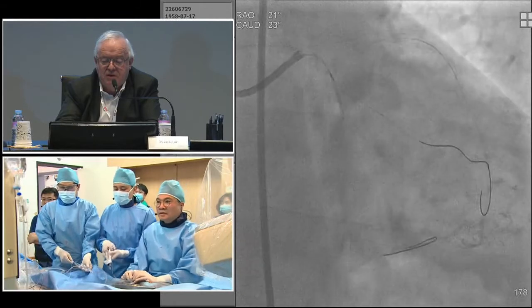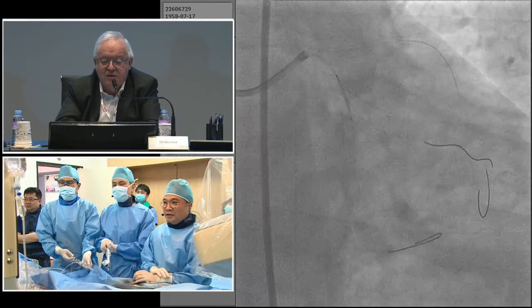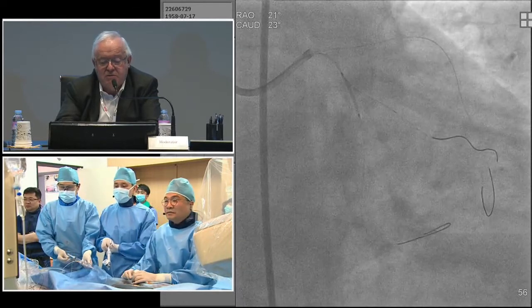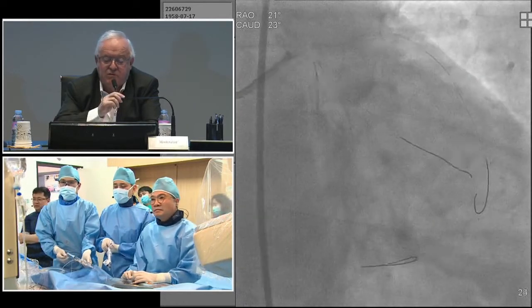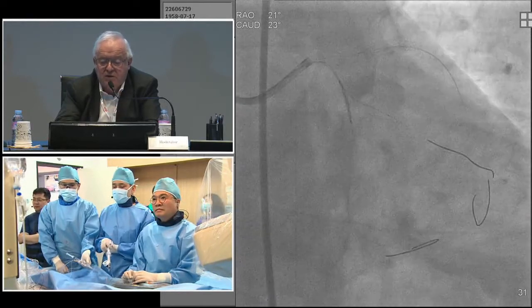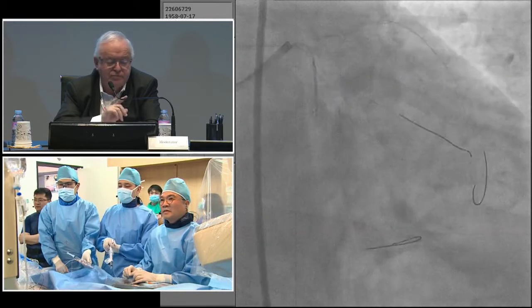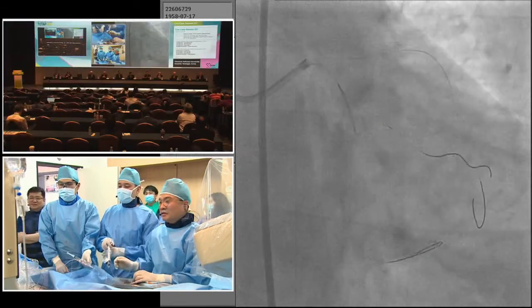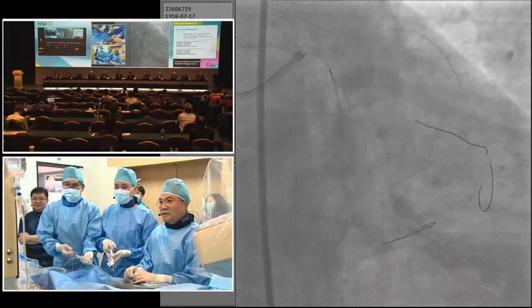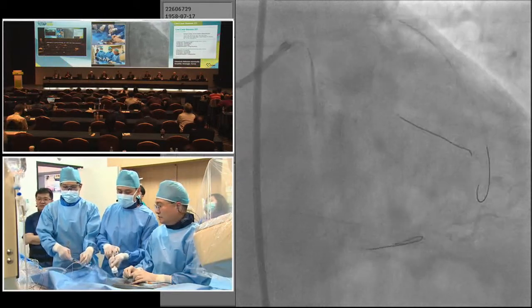So personally, I would have maybe stented towards the marginal, simple kiss with the distal circ, and after that probably stent left main to circ and kiss to LAD. I don't want that, because we can say even today that the number of stents is a factor of stent thrombosis. So if you do it this way, maybe we have to put a stent in the marginal branch also. Okay. Inflate. Great.